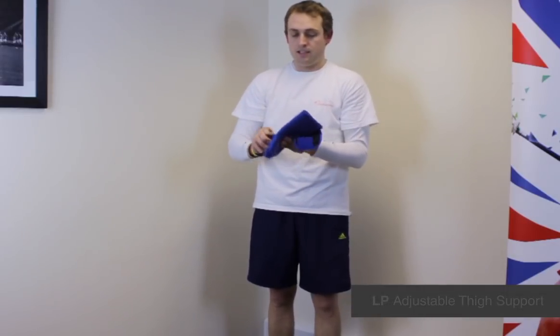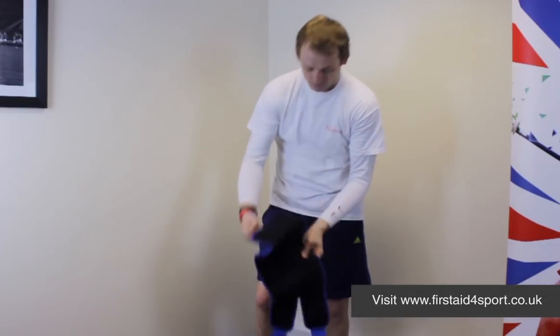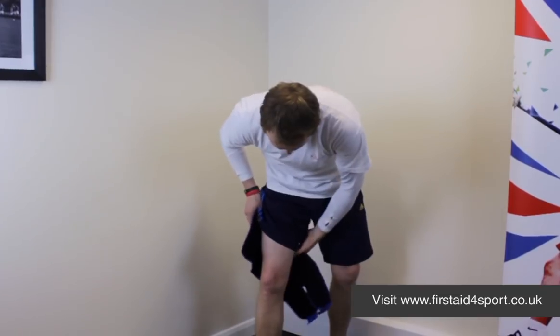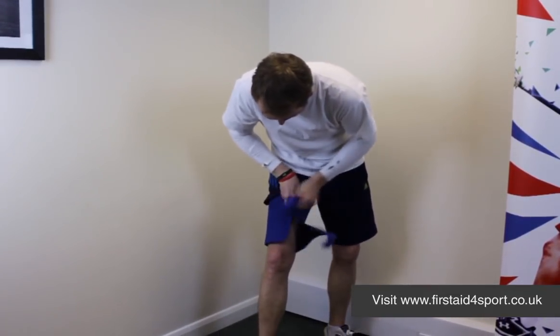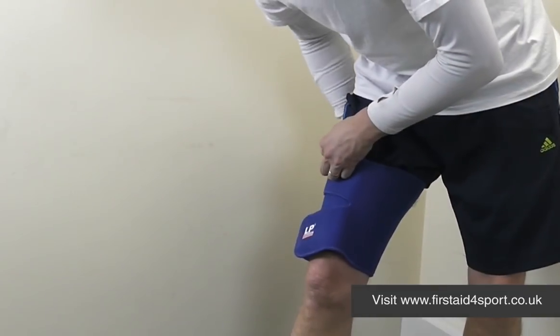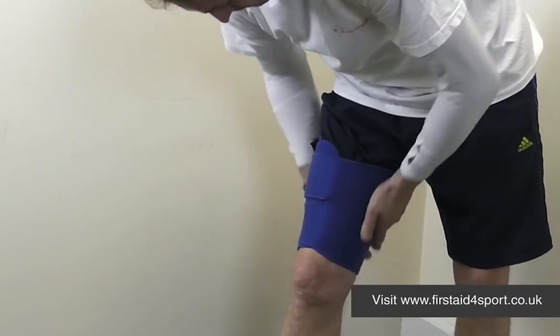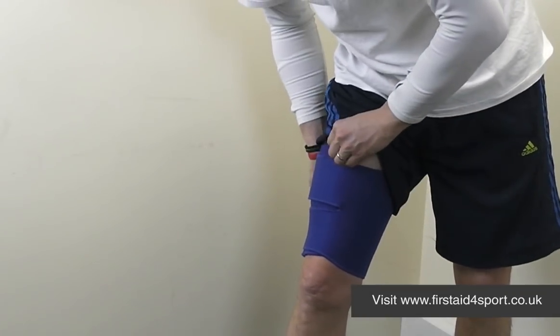So protect your hamstrings and your quads — open it up. It's a really simple system: wrap it round, wrap it round again. You can pull it as tight as you want.